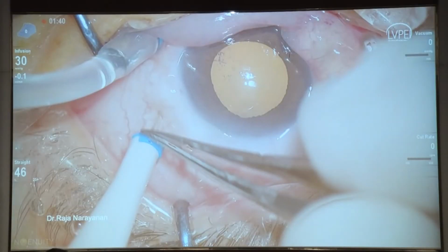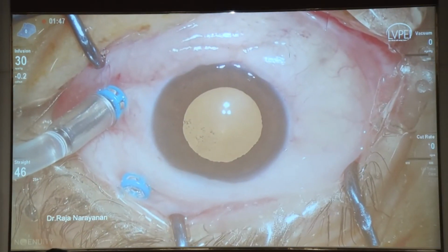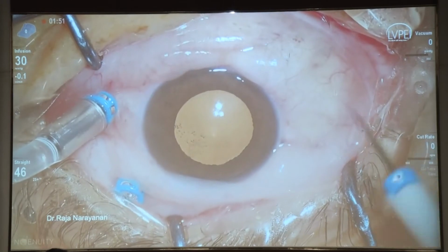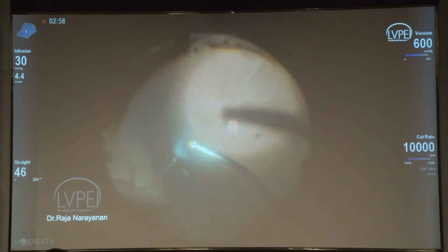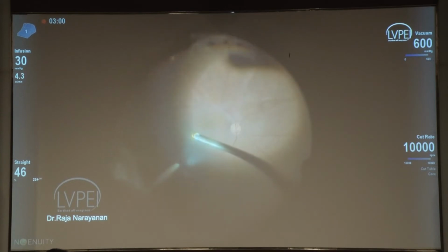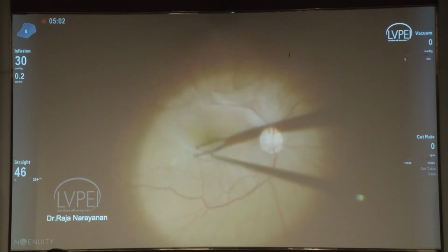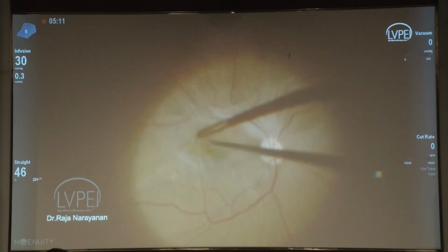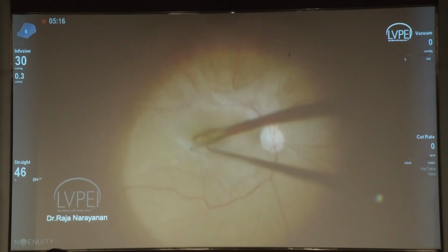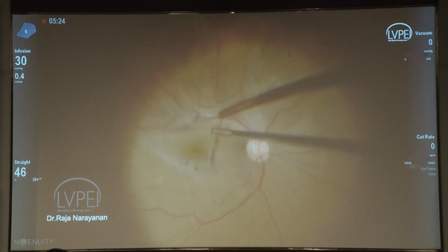So this is a video of a patient where we gave the dex implant at the end of the surgery. I'll show the technique, which may not be that simple, or initially you may have challenges in how to give the dex implant at the end of the surgery. So a standard 3-port pars plana vitrectomy has been done, and then we are removing the epiretinal membrane. In these cases, I tend to also remove the ILM after staining. After peeling the ERM, I stain the ILM and remove the ILM.